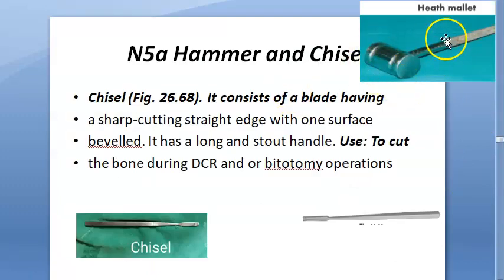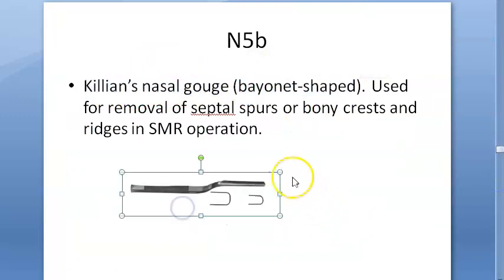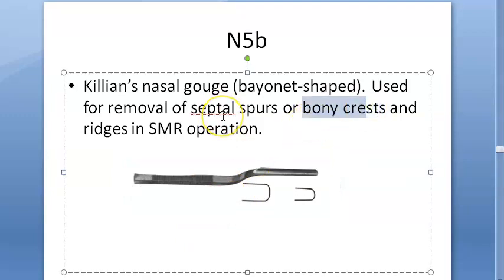Then you have the hammer, also called a mallet, and chisel. You use these to cut bone during DCR and other procedures. Next is Killian's nasal gouge — bayonet shaped — used to remove septal spurs or bony crests. It makes sense: it's used to remove bone, so it's a very strong instrument.